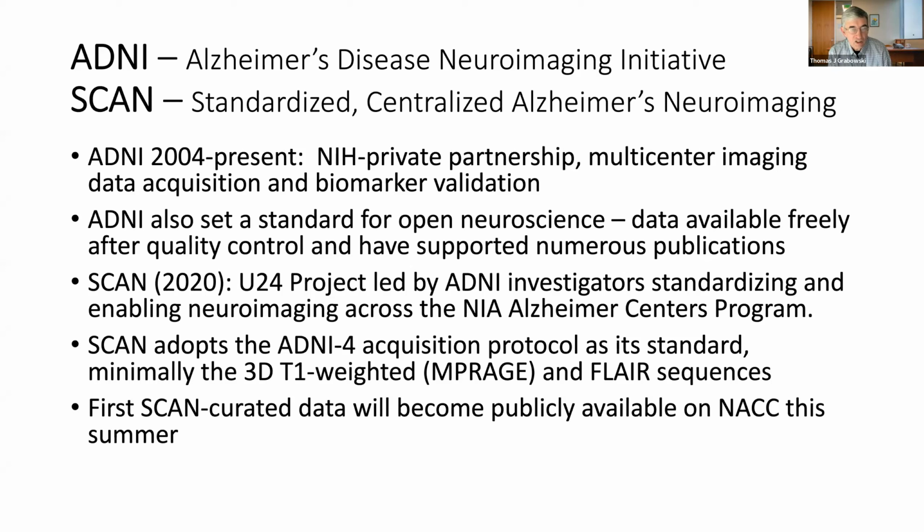The SCAN initiative, SCAN stands for Standardized Centralized Alzheimer's Neuroimaging, is related to ADNI in that SCAN is using the same imaging sequences that ADNI has developed, but is more specific to the Alzheimer's Centers program, and it's a scaled up version of ADNI. So it's a U24 mechanism project that is enabling neuroimaging across all the Alzheimer's centers, including ours.